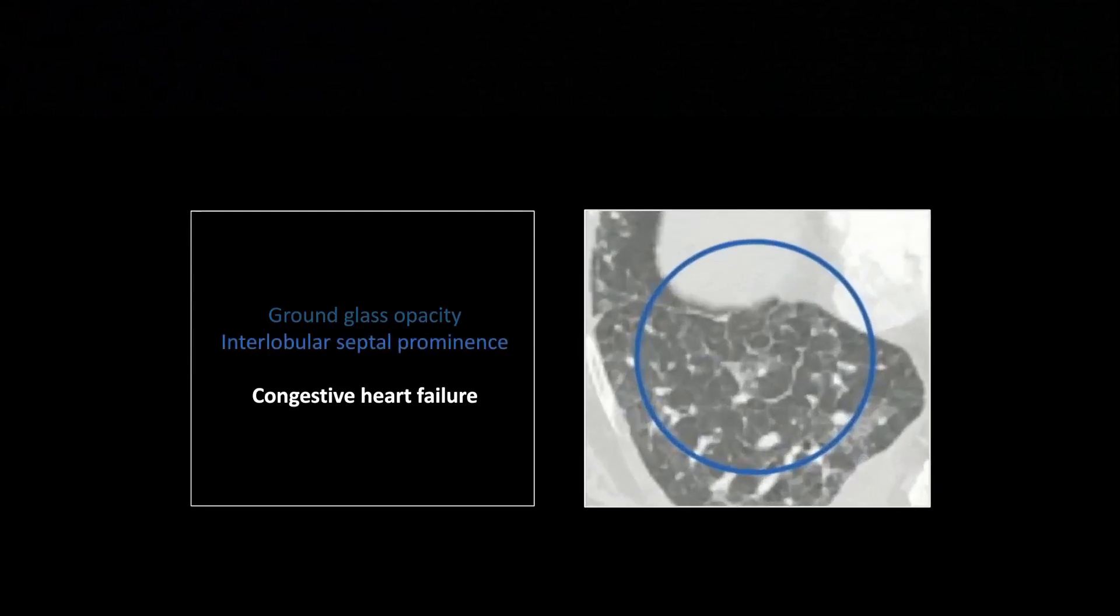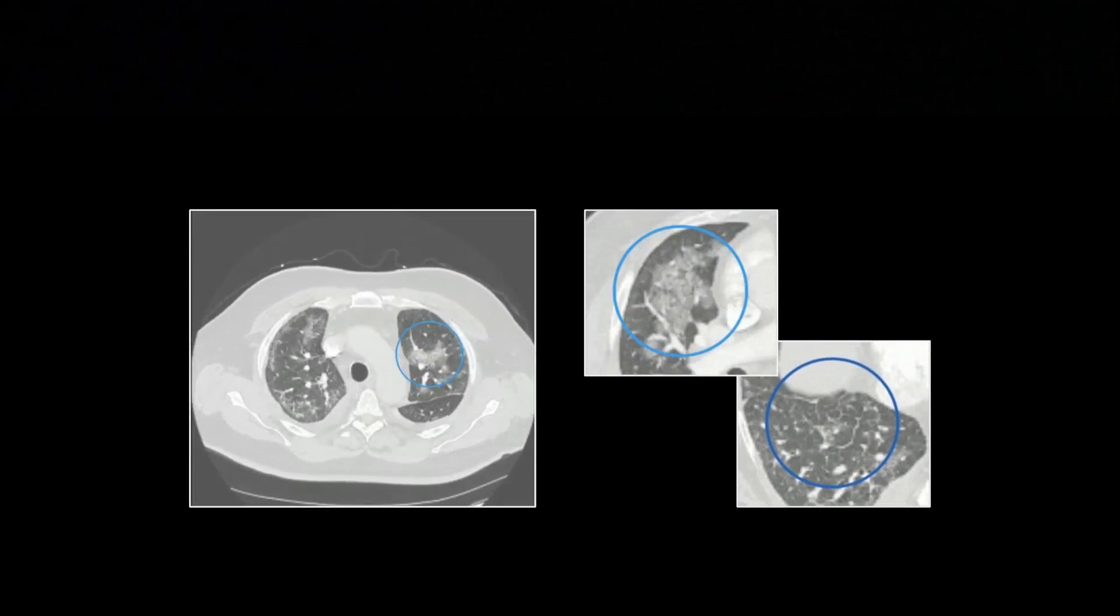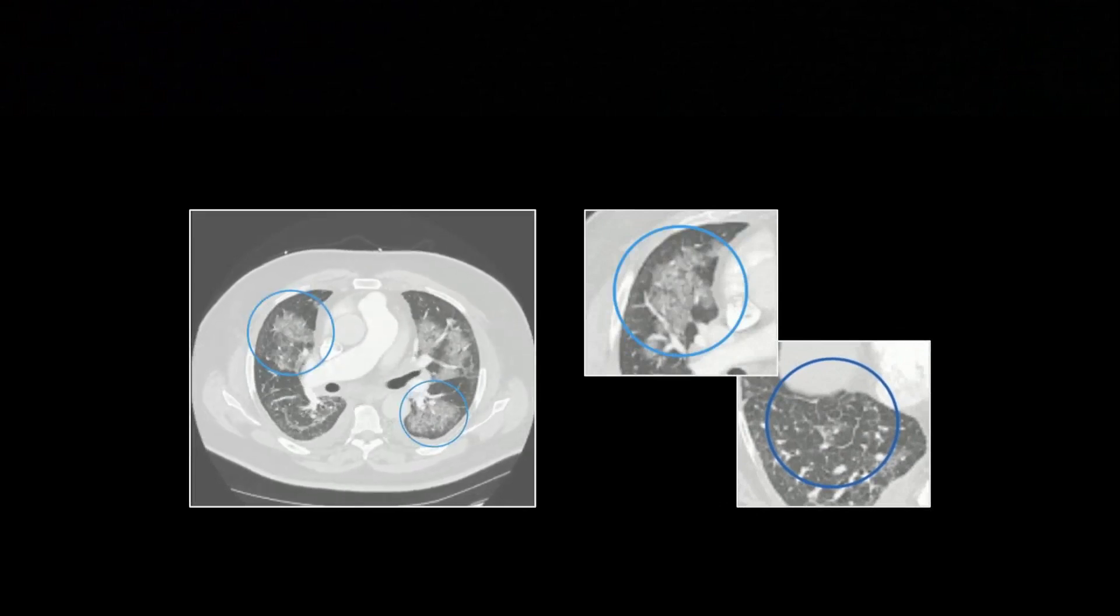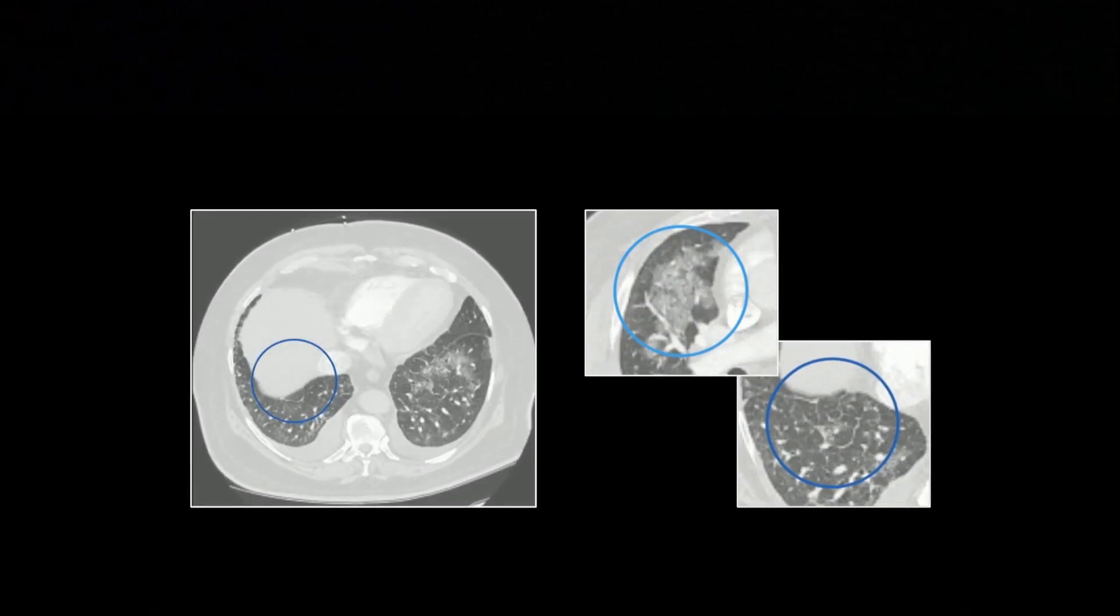The thing that really seals this for me is this is an example of interlobular septal thickening. You see in the central portion there, it almost looks like a bunch of linked hexagons. They're a little larger than you would expect for it to be crazy paving. This is congestive heart failure. It's central in the lobes with the ground glass density. Another old trick one of my attendings gave me was sometimes when you get stuff that is so dense you can't tell what's going on, look to the edge of the involved region.